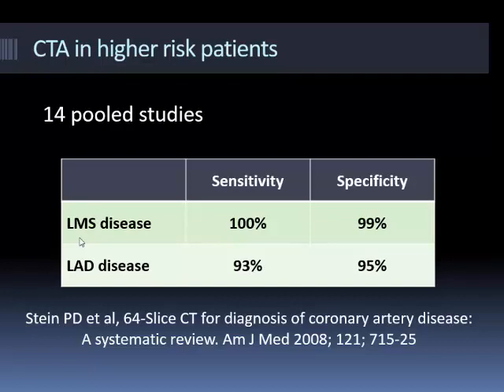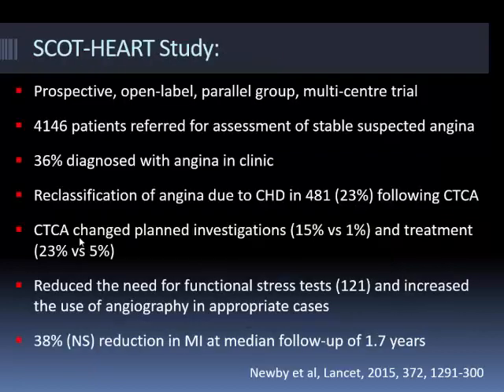Obviously, if you've got no significant stenosis, that makes it a little bit easier. I suppose where it can also be helpful, if you've got to remember in certain vessels, if you've got diffuse atherosclerosis, even though you may not have more than 50%, the extent of atherosclerosis may be sufficient that it can actually cause symptoms. So I suppose you may be able to identify that group.